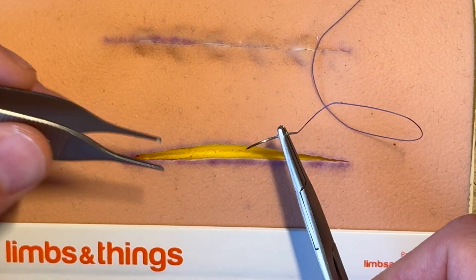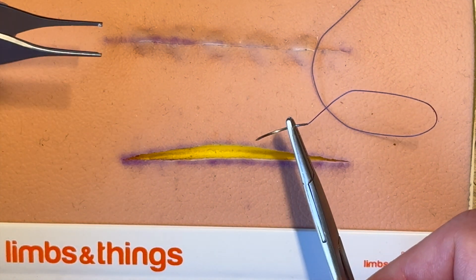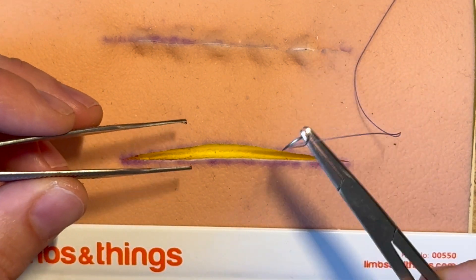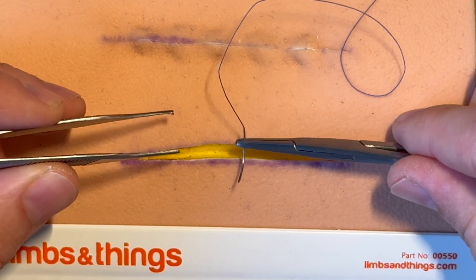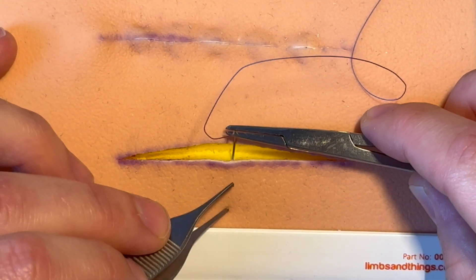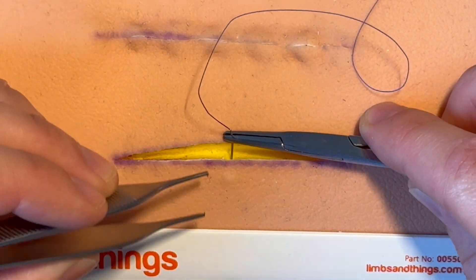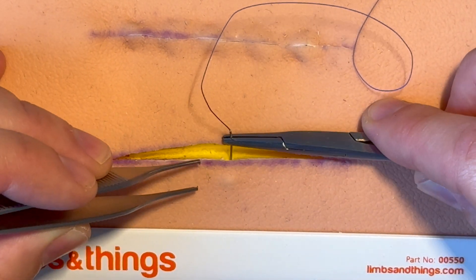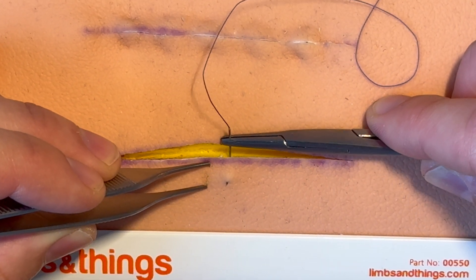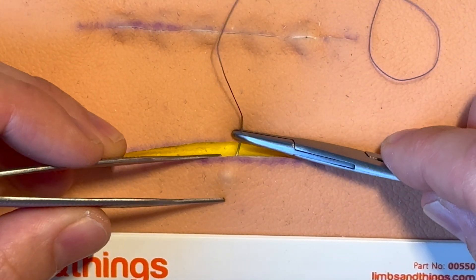You want the knot as deep as possible so that it absorbs nicely and doesn't come out through the wound — that means you start deep and finish deep. The way it's usually taught in this vertical fashion is you put it into the subcutaneous tissue, come back a little bit from the skin edge. You can see a little dimple, but you don't want to push it so far that you see the steel — just see a little dimple — and then you bring it back on itself.